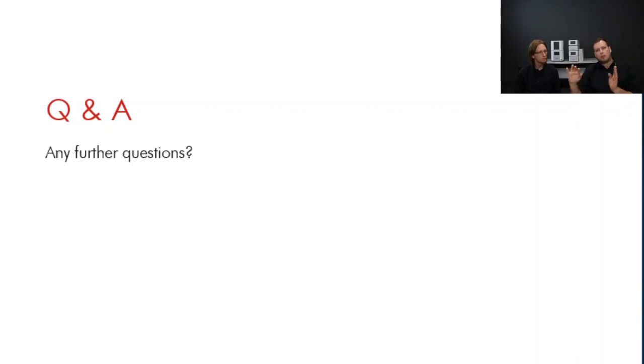When you're using the automated scripts, this is taken care of, so that you as a user do not have to work or think about that. Exactly. But further support-oriented topics we would like to save for a future webinar because it's so in-depth, and we don't want to jump the gun by covering things that might not make a lot of sense for everyone just yet.